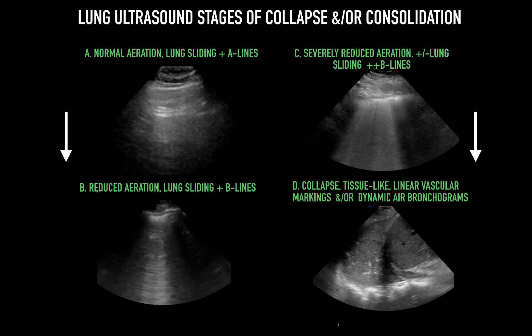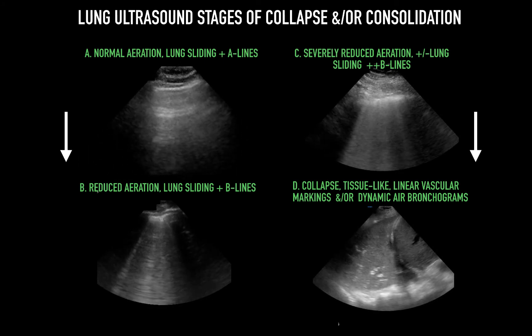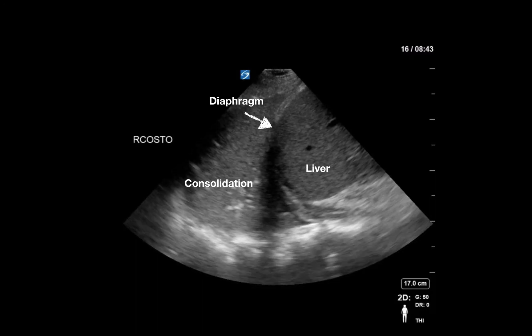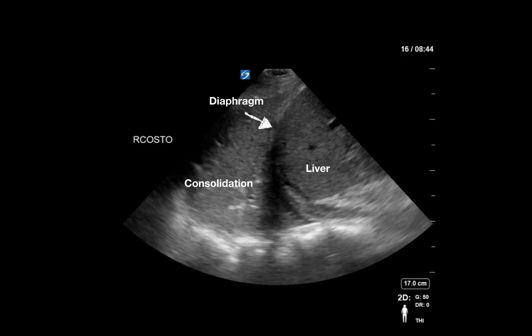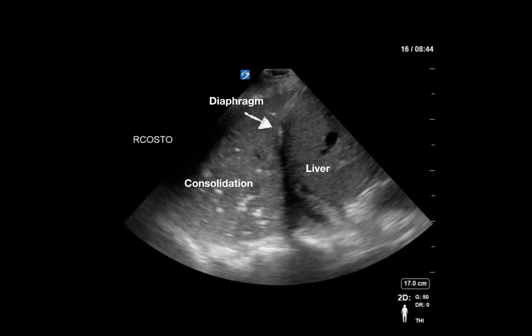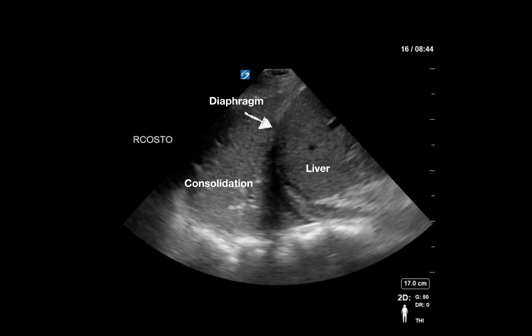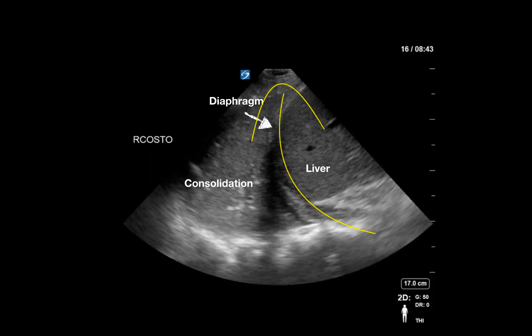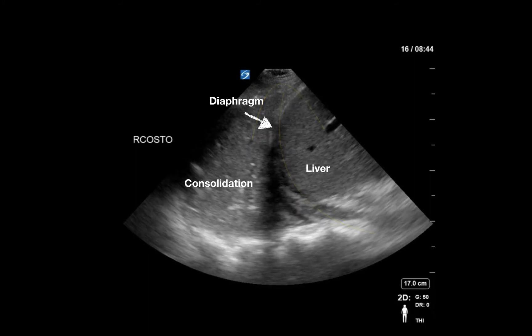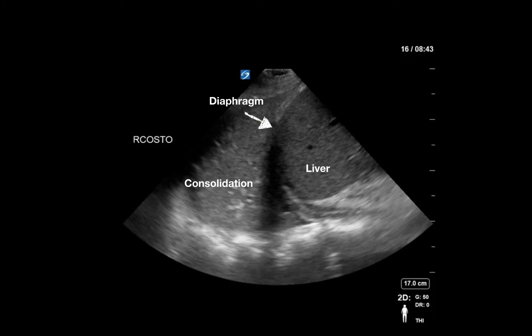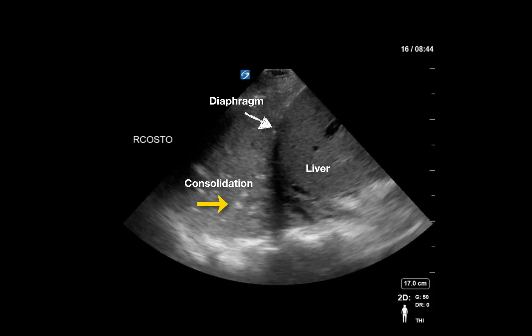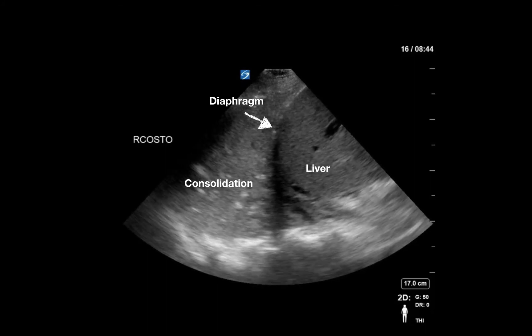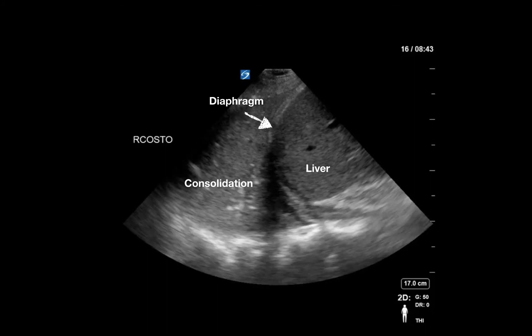This can sometimes be helpful in multifocal pneumonia to differentiate it from cardiogenic pulmonary edema. Consolidations can look like hepatized lung on ultrasound. However, a consolidation without surrounding fluid can be difficult to identify properly. A standardized view is critical — ensure that the probe marker is cephalad, or towards the head, and that the screen marker is on the left. Identify the diaphragm well to establish what is pleural versus abdominal cavity. The main distinguishing feature, other than the diaphragm, is bright punctiform lesions that represent air-filled bronchioles surrounded by tissue, and anechoic pulmonary vasculature.